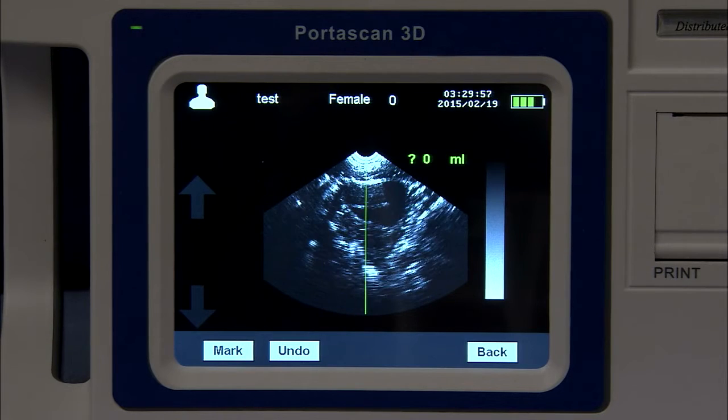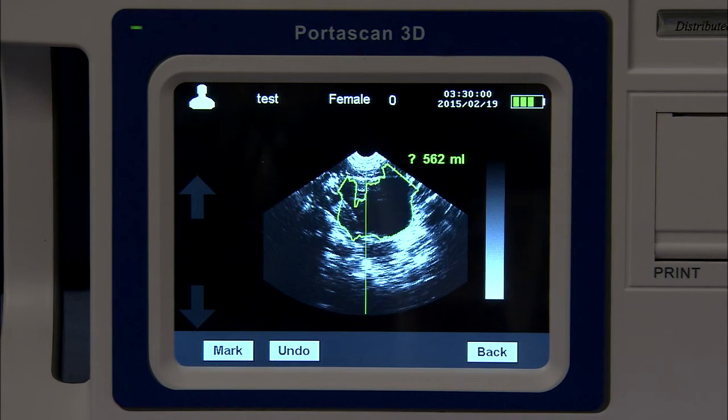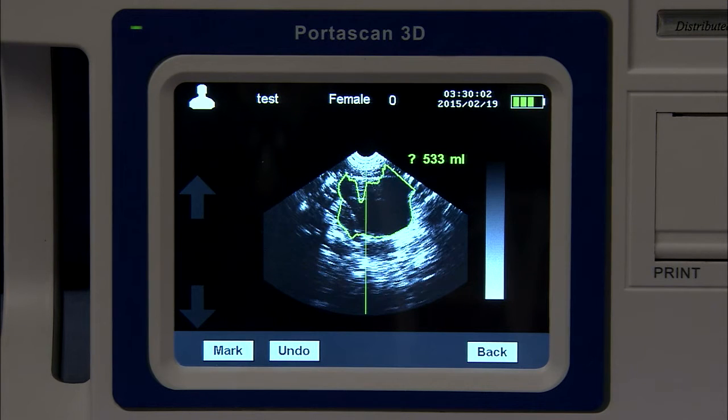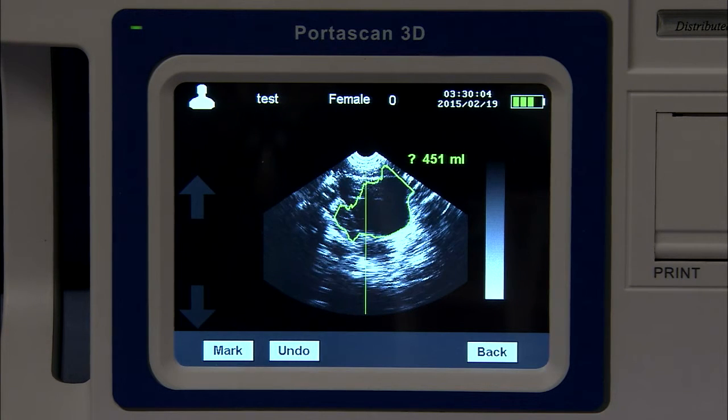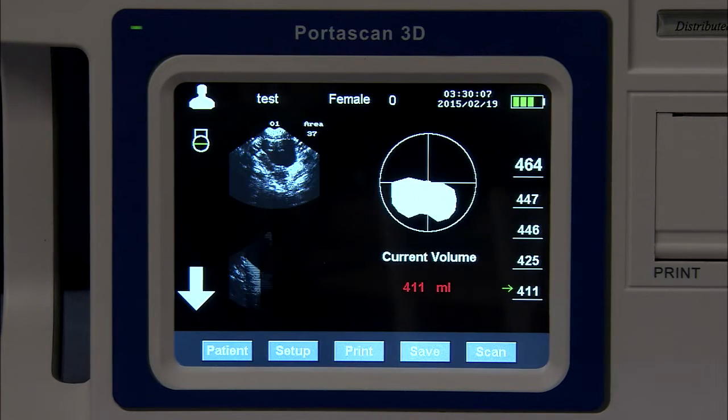One of the nice features is that you can hold the button down and get a live image as displayed on your screen. Once you feel you have an accurate image of the bladder, release the button. This will allow 12 captured images of the bladder to be taken, which will then calculate the accurate volume the bladder contains.